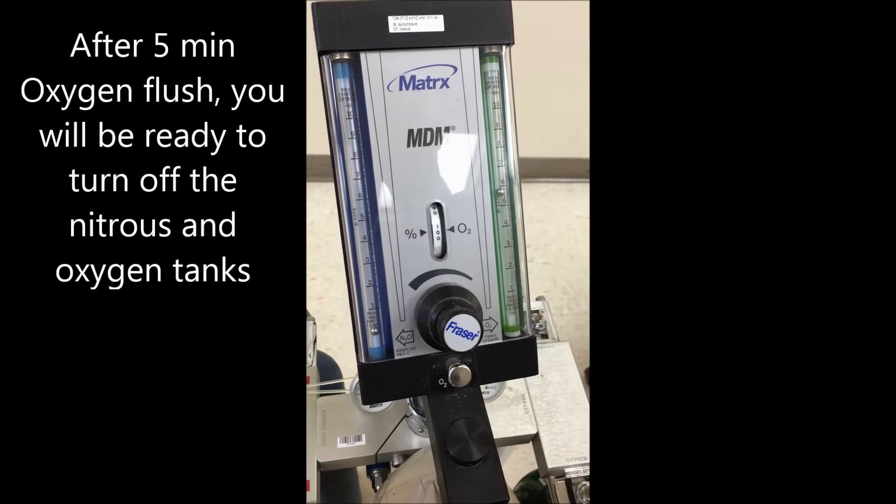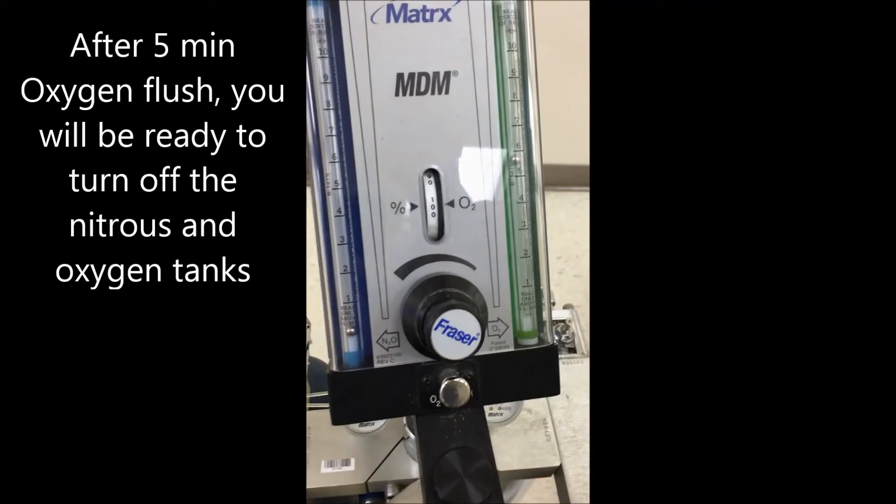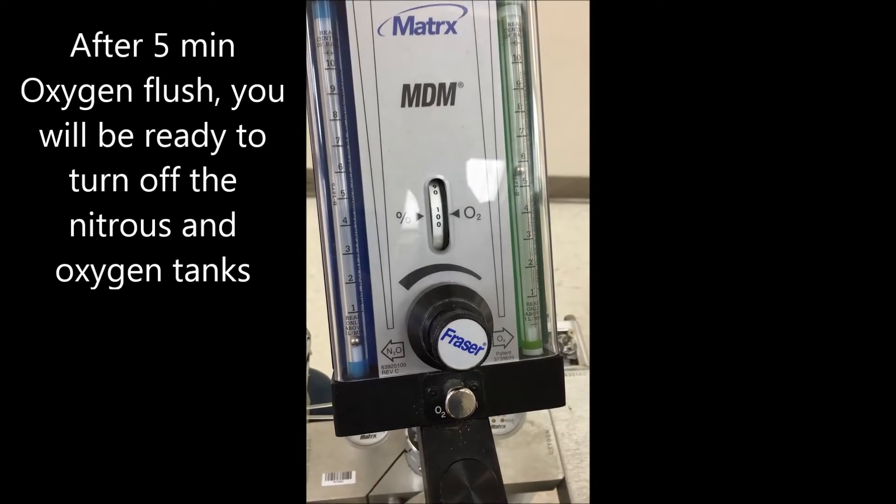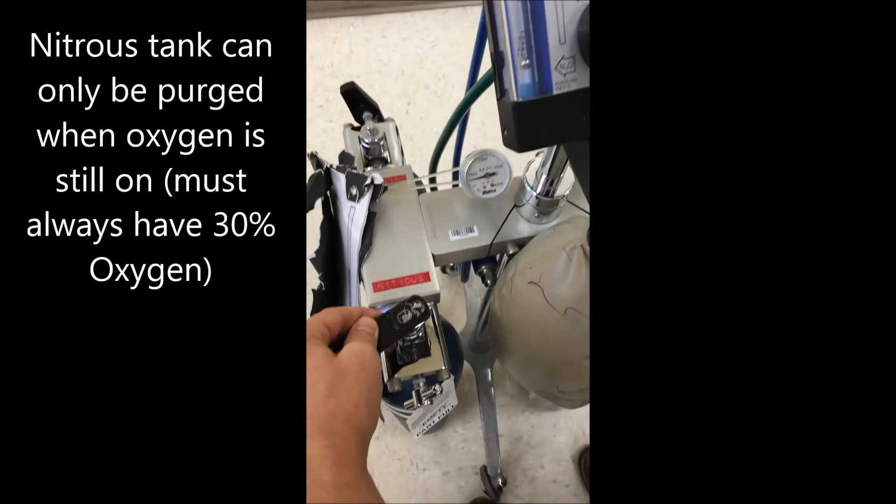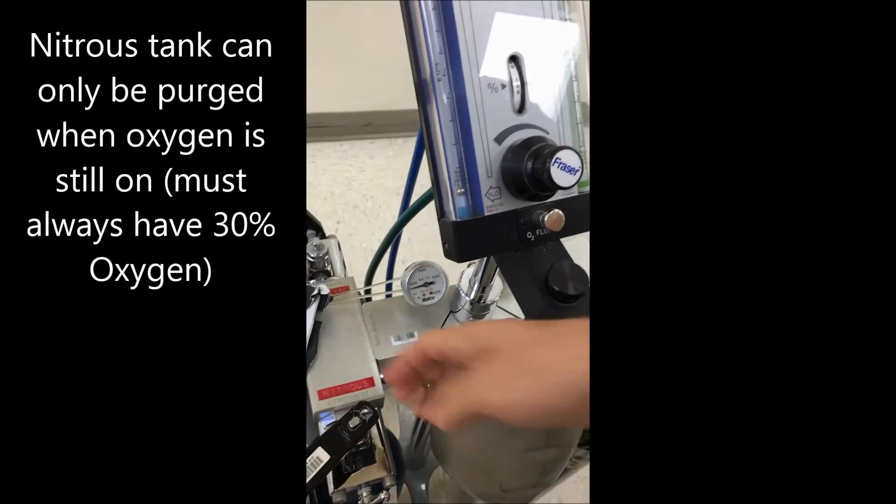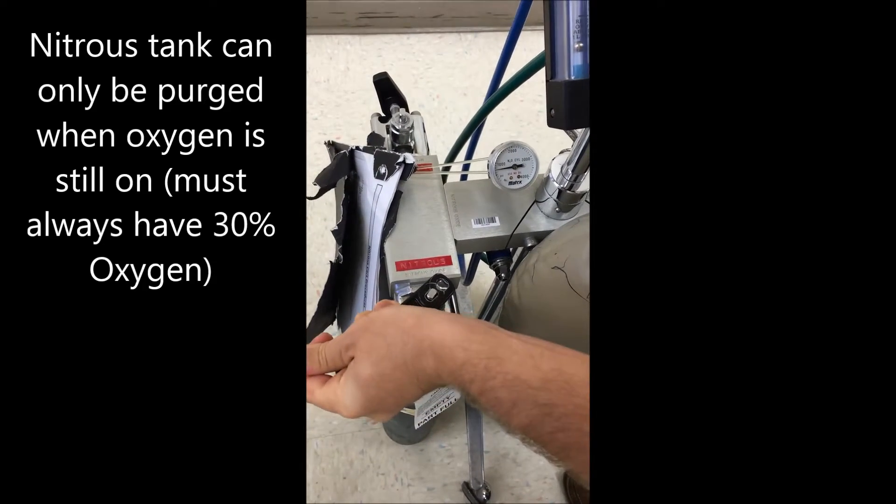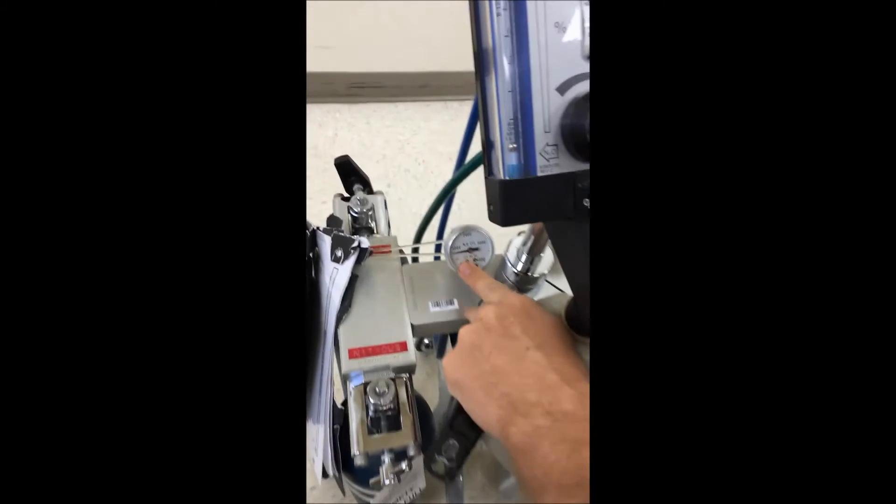So we're on 100% oxygen now and we want to turn off the machine. We want to first purge the nitrous, so we have it on oxygen. We turn off the nitrous tank, leaving the oxygen tank on. Notice PSI is still there.